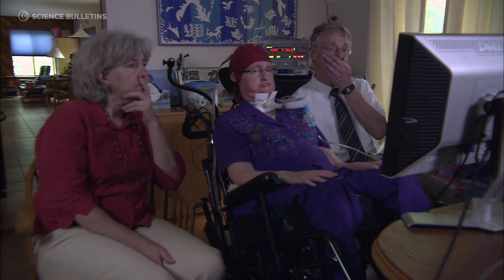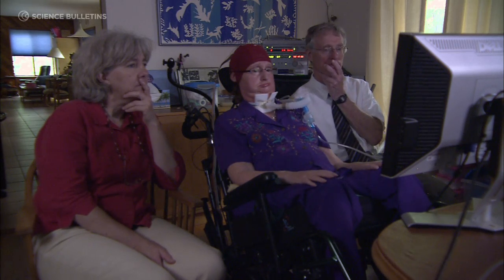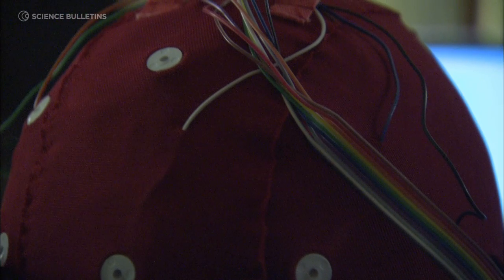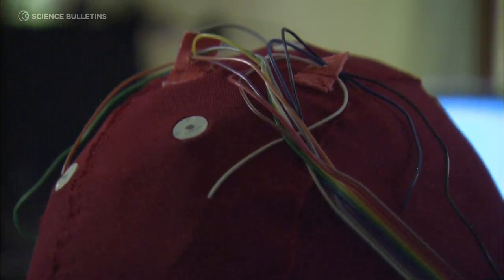The kind of system that Kathy is using is a very simple brain-computer interface using EEG recorded from the scalp, and it works pretty well. But when you record from the scalp, you have activity from the muscles of the head, from the eyes, from head movements — other kinds of non-brain noise that you have to recognize, contend with, and filter out.